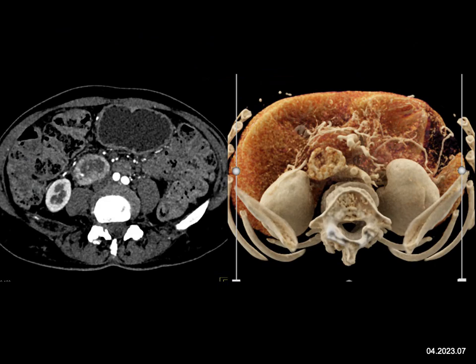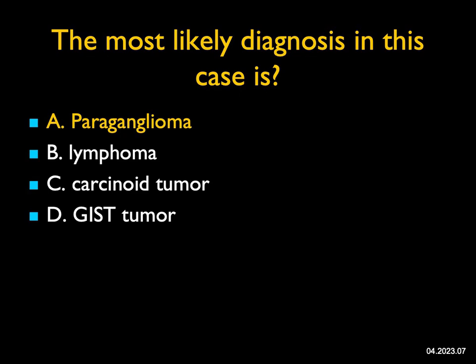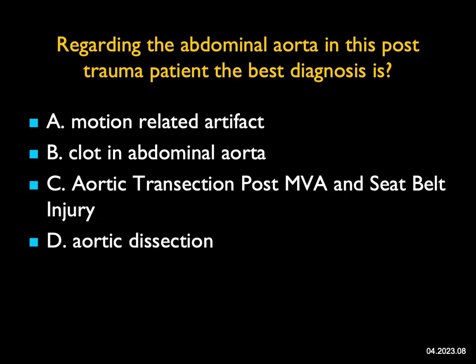The most likely diagnosis here — from the axials and 3D cinematic rendering we see a posterior right-sided mass that's vascular around the periphery with central necrosis. Lymphoma is usually not vascular; carcinoid or neuroendocrine tumor is a possibility; GIST tumors can be vascular arising from the stomach or small bowel. The best diagnosis is a neuroendocrine tumor — specifically this was a paraganglioma, which fits the location well.